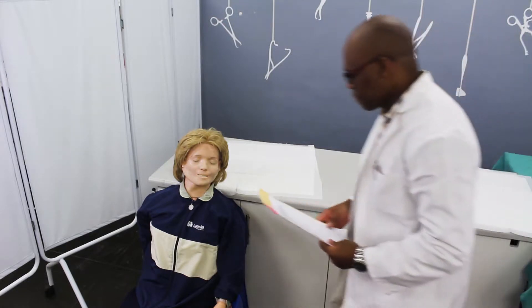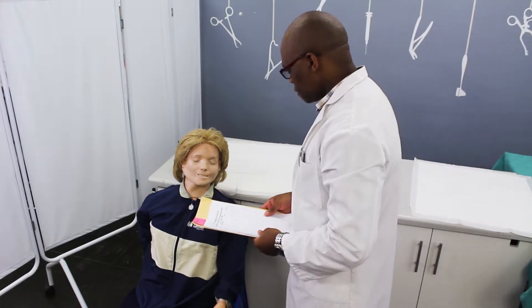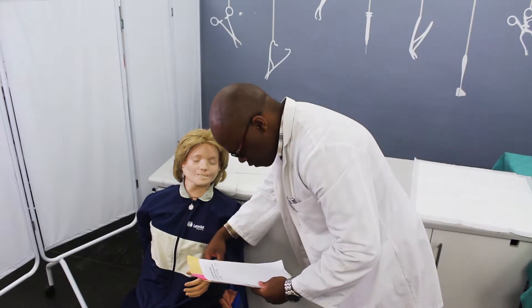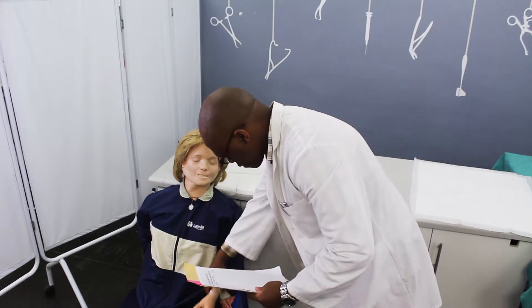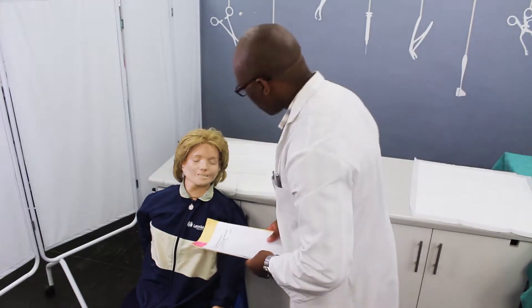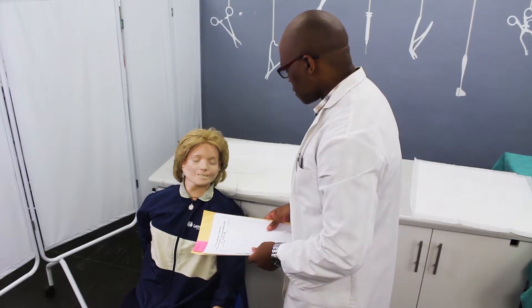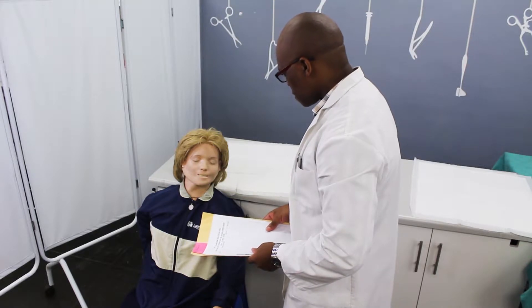Introduction and preparation. Greet the patient and introduce yourself. Confirm the patient's identity by asking for his or her name and checking the armband. Explain the procedure and ask whether the patient has any allergies, questions, or concerns. Obtain verbal consent from the patient for the procedure.